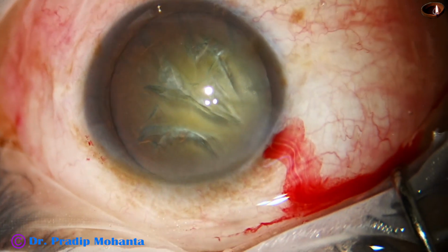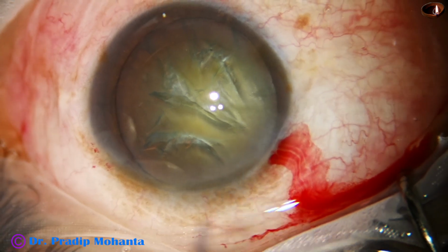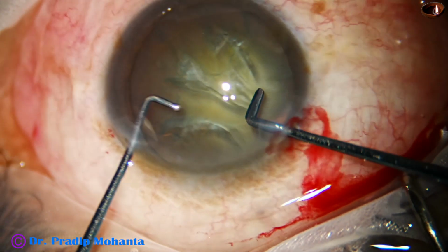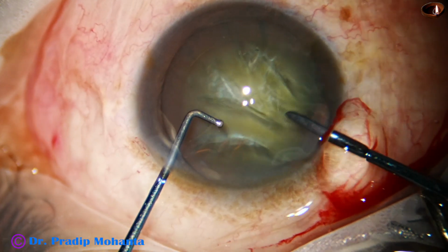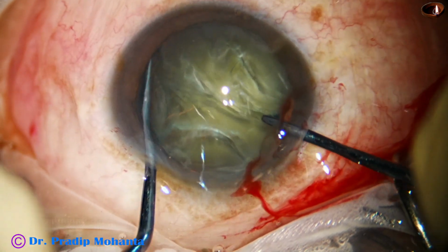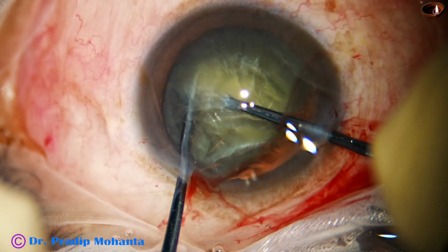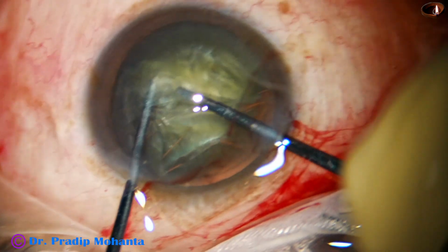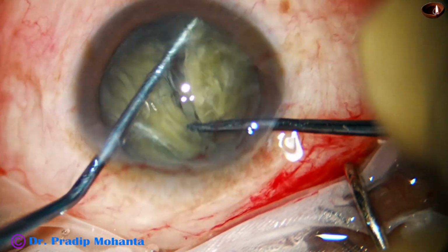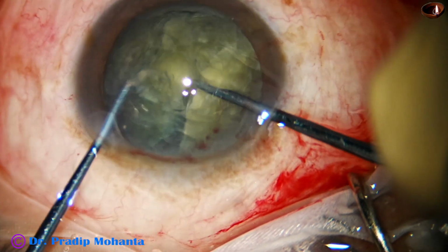And now we are going to use these two instruments, the Prechopper and the Nucleus sustainer. So the Prechopper goes and just in front of the rhexis it is engaged in this way. The sustainer goes and hooks the opposite equator. The two instruments are brought to each other and lateral separation is done. Usually the Prechopper goes more distance than the sustainer.